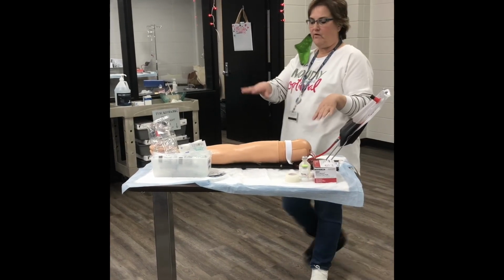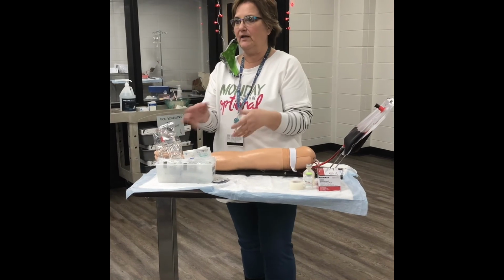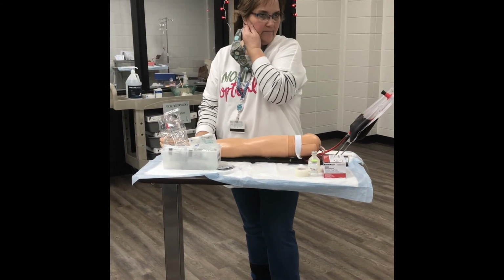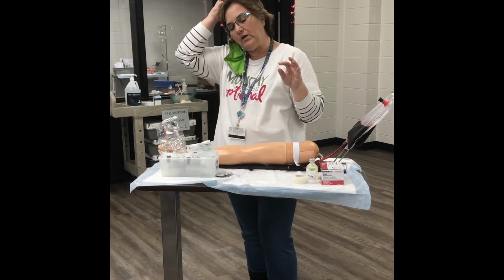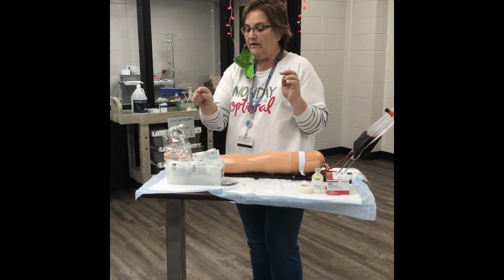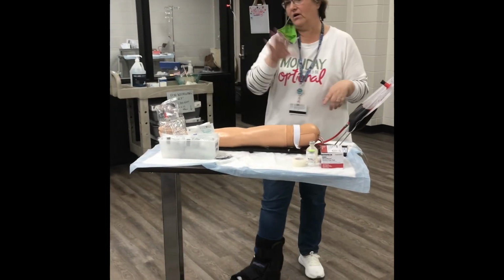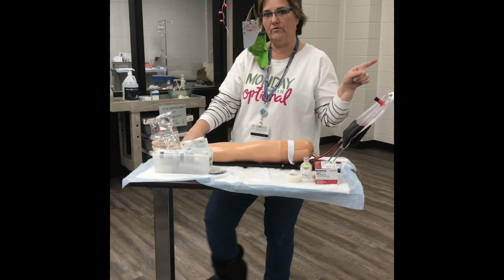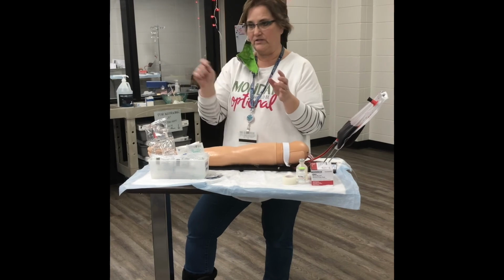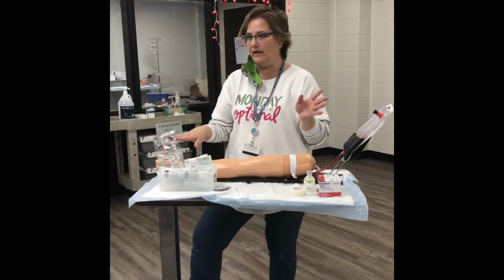You'll have an arm, you'll have a little IV case, got everything you need in it, so you don't have to memorize everything you need. It'll all be right there. But just remember, when you do this competency, giving IV fluids is giving medication. It's considered medication, so you got to do all those rights of med administration that you do on your IV med competency. You're going to have orders, you're going to have an MAR, just like you did in there. Check your orders to your MAR, make sure it's correct.